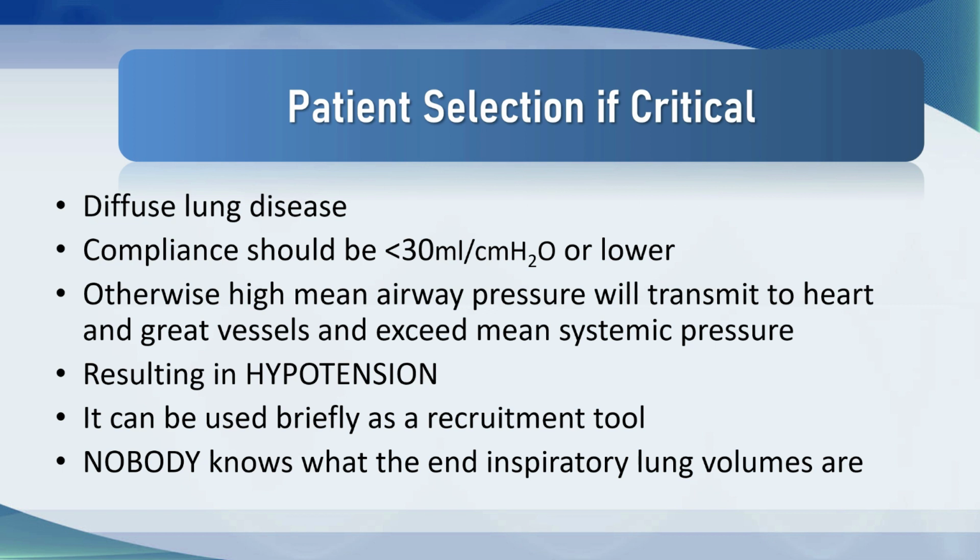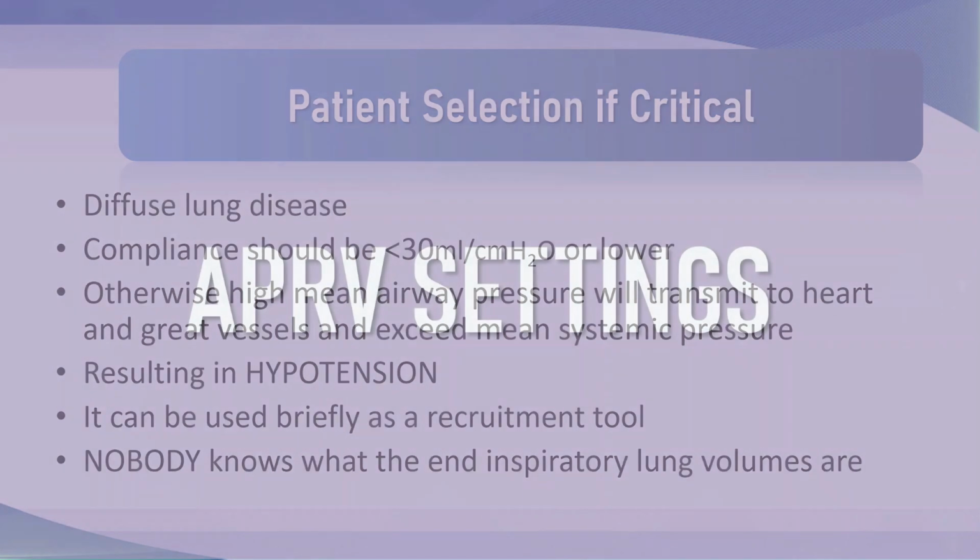However, that is entirely possible in airway pressure release ventilation, because even though the release volumes may be fewer than 6 mils per kilo, with that little extra bump of the spontaneous breath, who knows? Also, really don't know what the transpulmonary pressure is either.